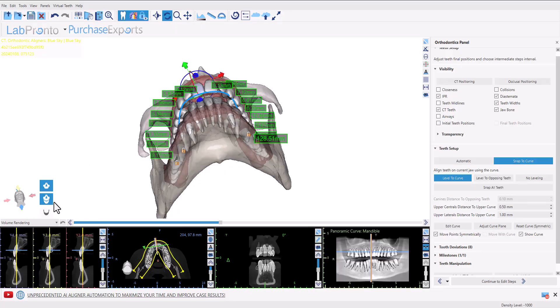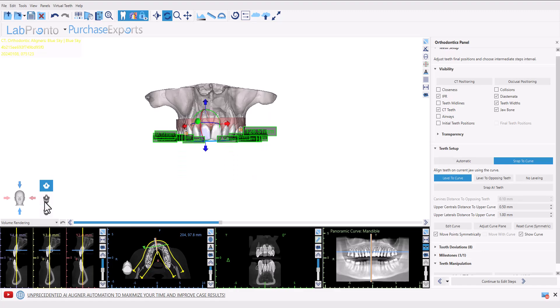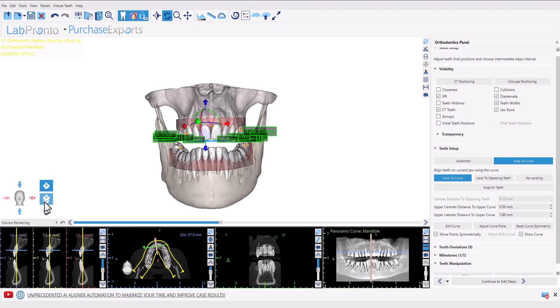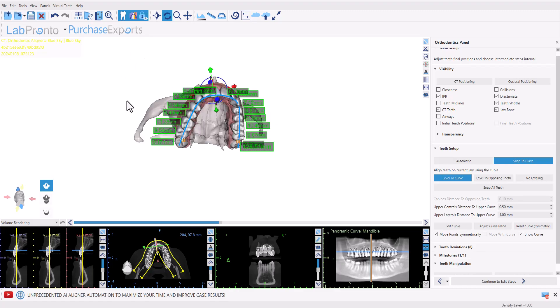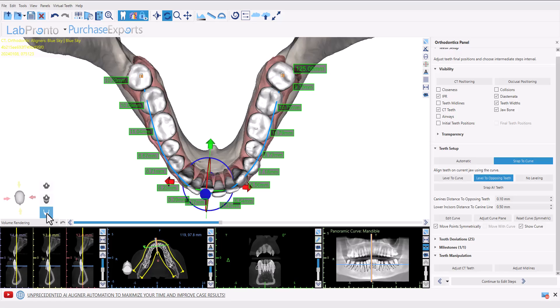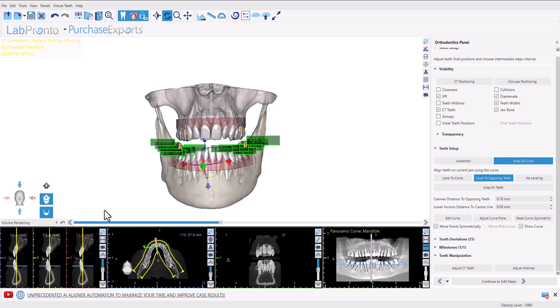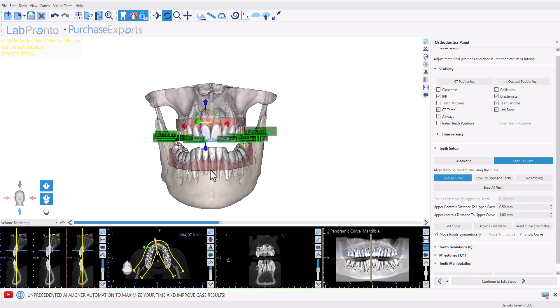You can view a single jaw by deactivating both jaws in the bottom left on the icon right here. You can change the active jaw simply by clicking on the opposing arch. If both jaws are visible, you can change the active jaw just by clicking on the relevant jaw.